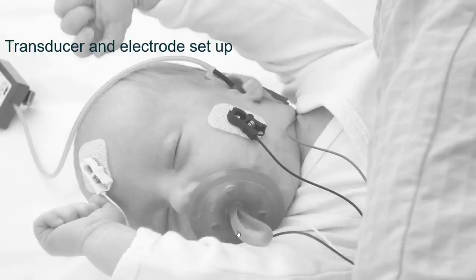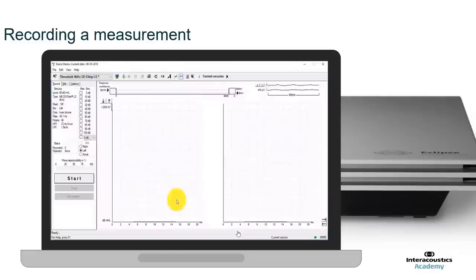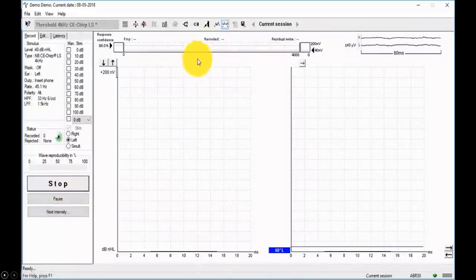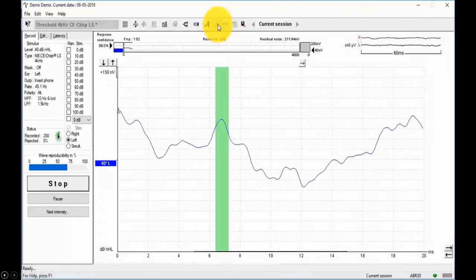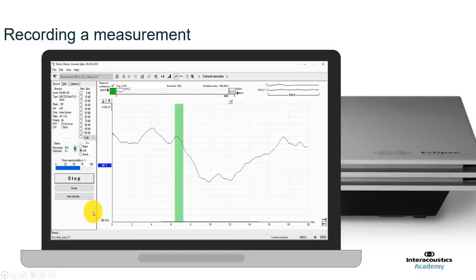Before starting testing, separate the transducer and the electrodes. Place the transducer above the patient's head so the insert earphone comes from behind the patient, and rest the pre-amplifier near their chest with the electrodes coming up. This eliminates stimulus artefact — if the two cross, you will get stimulus artefact in your recordings. Also make sure electrode cables are braided to reduce noise common between electrode sites. Now we're ready to perform a measurement. We'll choose a stimulus in the left ear at 40 dB and see what response comes through.